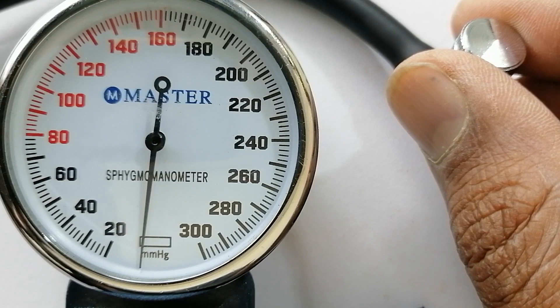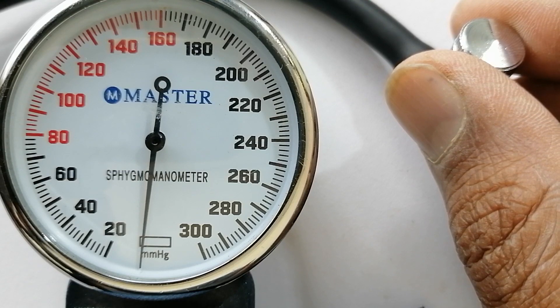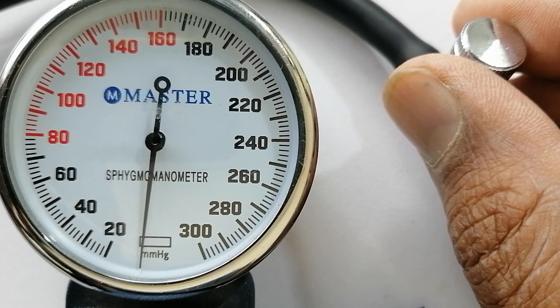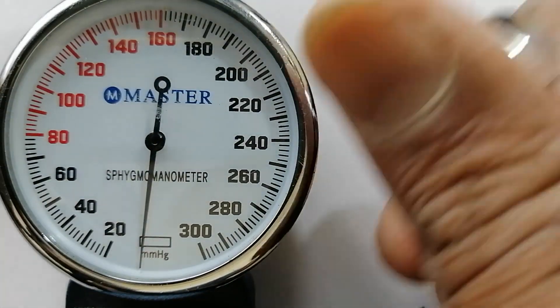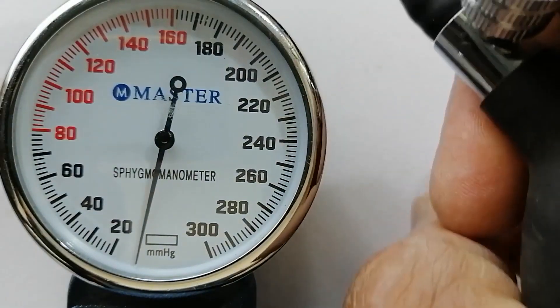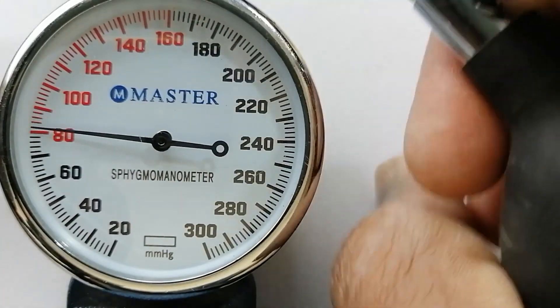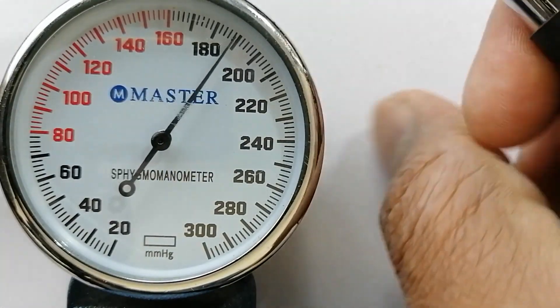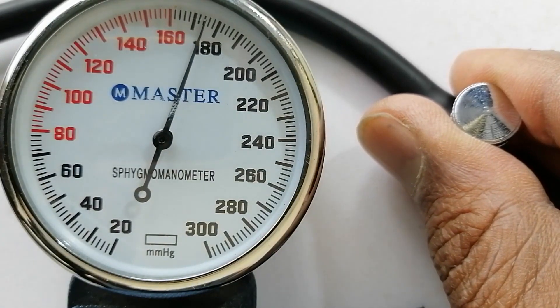Now I'm putting pressure on 180. After that I will release the pressure. You have to take note of when the sound of the pulse comes to you. Pay attention to your ears. I have closed the valve completely. Now I'm starting to fill the air.